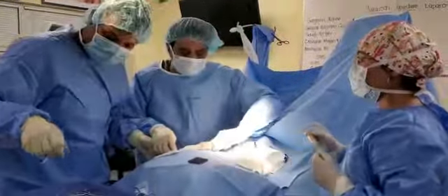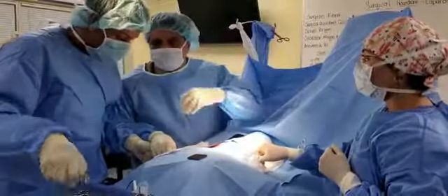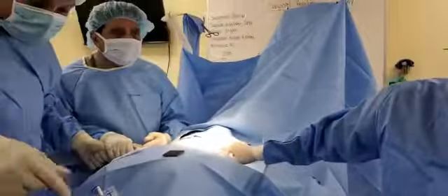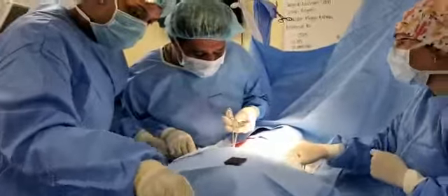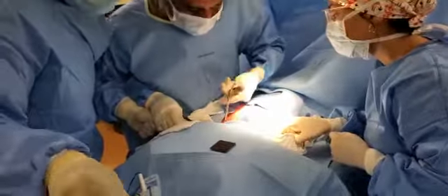Okay, now we are going to split up the muscles with the hemostats. Give me the straight hemostat. The straight hemostat is like a pin. What I'm going to do — because I've cut the muscle — the patient is here, this is the muscle, and I can cut these muscles.